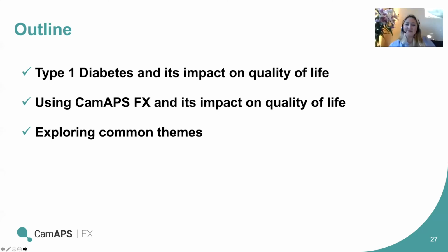Oh, we hope so. There are lots of exciting things that we hope will be happening. We're hoping that we might be able to start a trial shortly using the system but with faster acting insulin. There are faster and faster acting insulins becoming available. We've got some now, and there's more coming. And we're hoping to do a study where people use fully closed loop, so no meal bolusing. Like with everything, it will be done in a study first, in adults initially, and then, as with all the studies we've done so far, we do them in children secondly.